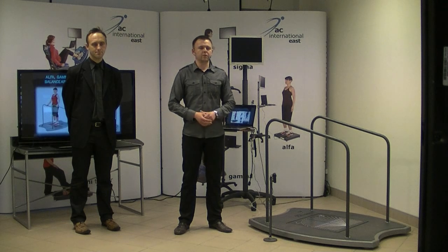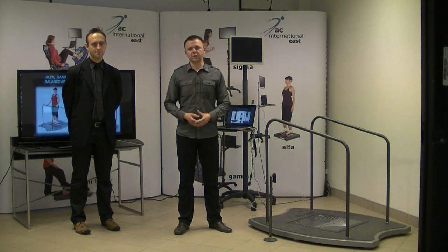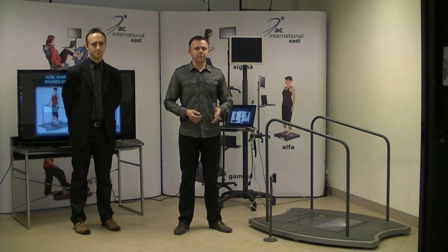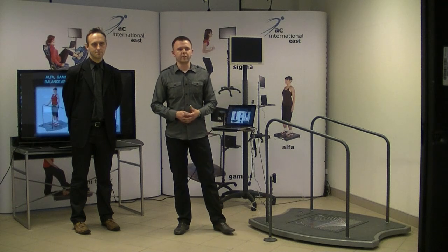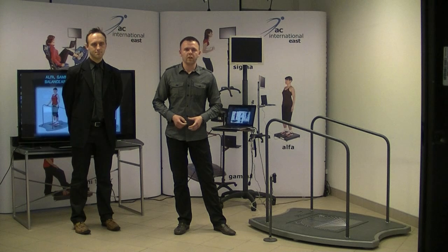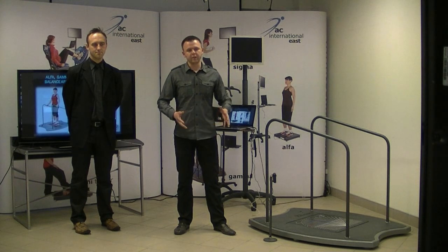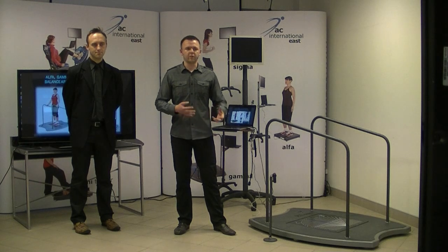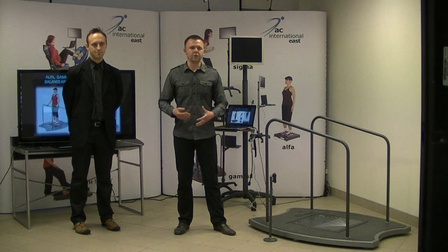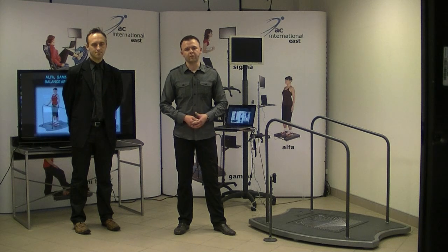After the testing, we can use 6 exercises designed for patient rehabilitation using biofeedback. After the diagnostic using the tests, we can choose different exercises which enable the development of an individual rehabilitation program. Each of them also has many modifiable options, so it can perfectly fit the patient's needs. Training can improve the patient's balance condition before measuring the dynamographic parameters such as squatting, jumping and gait on the second and third stage of the rehabilitation procedure.